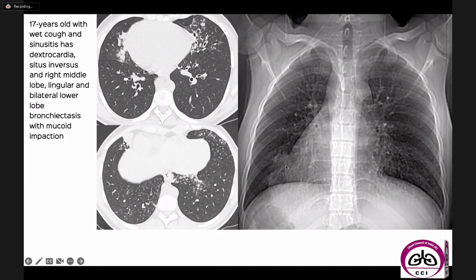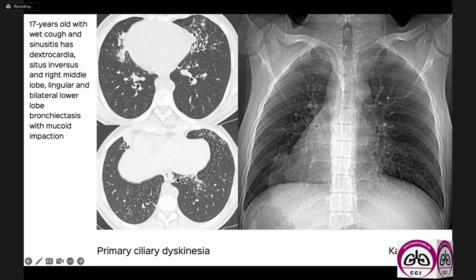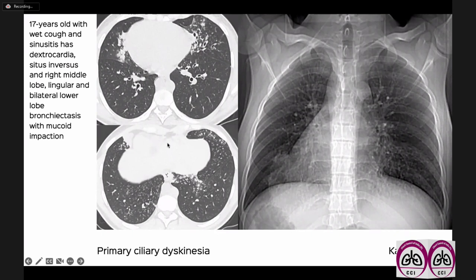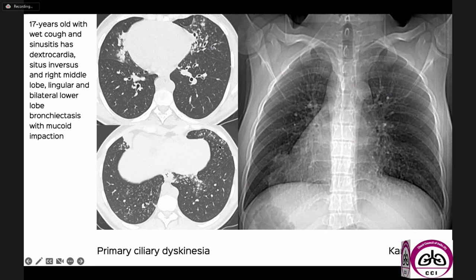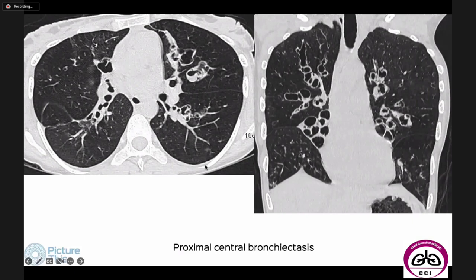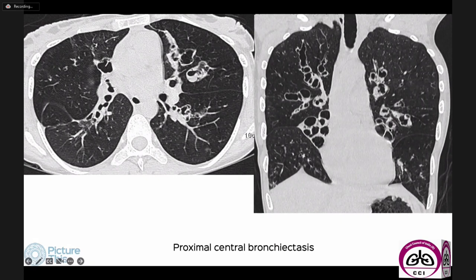When PCD occurs with dextrocardia, we can diagnose Kartagener syndrome, which is a subset of PCD occurring in about 17 to 20 percent of PCD patients. Again, you can see the right middle lobe, lingula, and lower lobe disease — bronchiectasis, mucoid impaction, and inflammatory bronchiolitis all together.